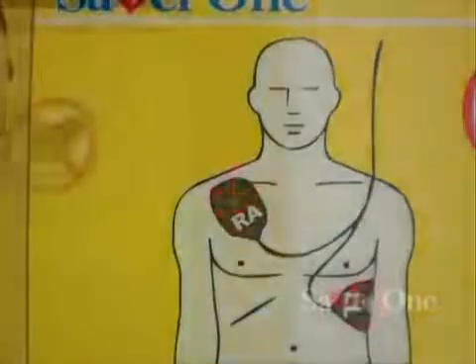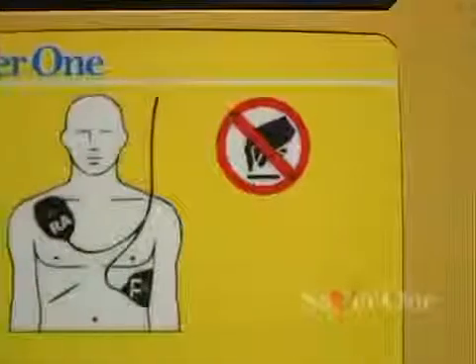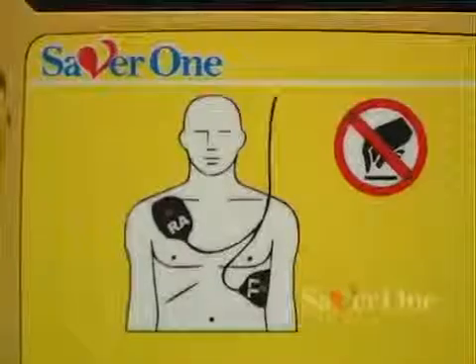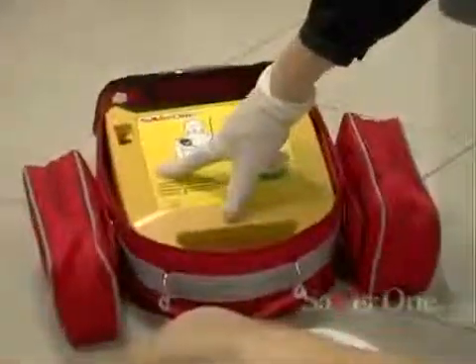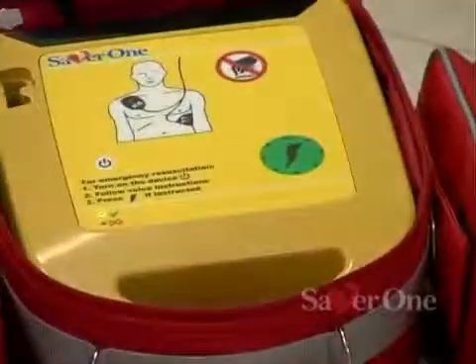The Saber One allows to help anyone, regardless of age and weight, adult or child. The rescuer is only to be aware of which kind of patient he is going to help. And if the patient is a child, special adapter and pediatric plates must be used.